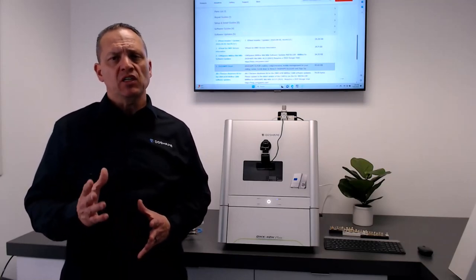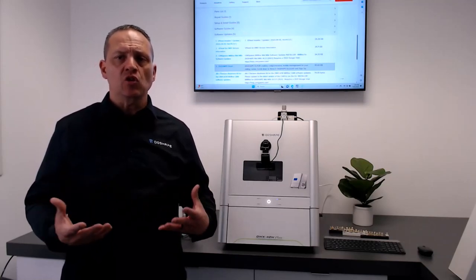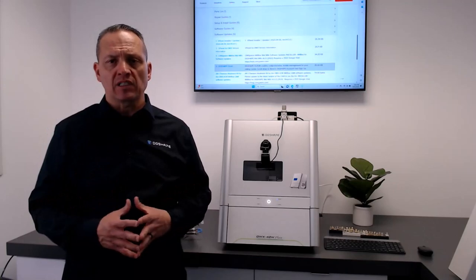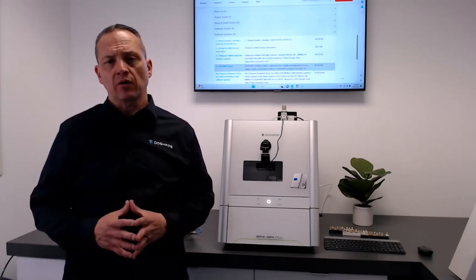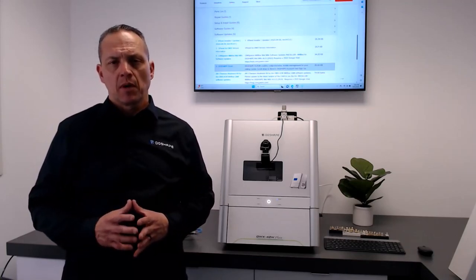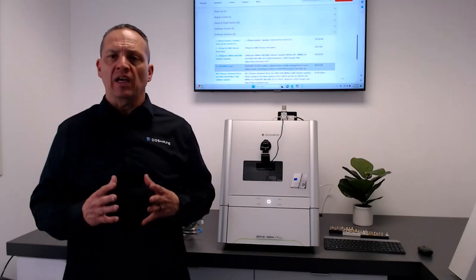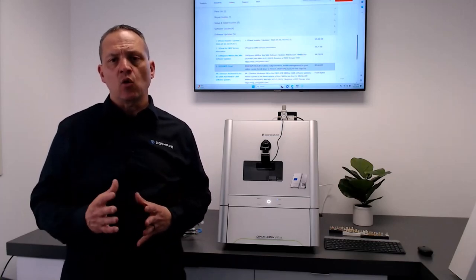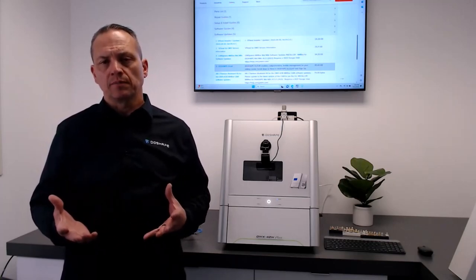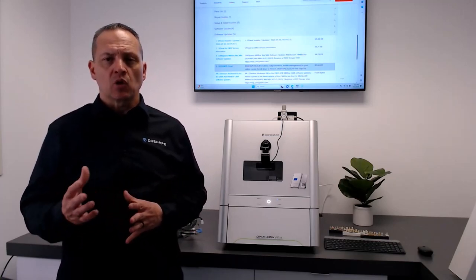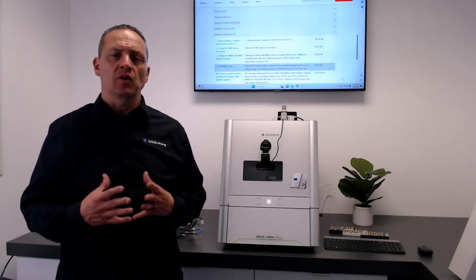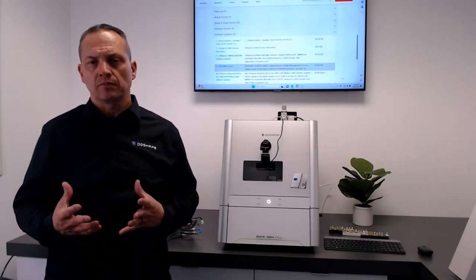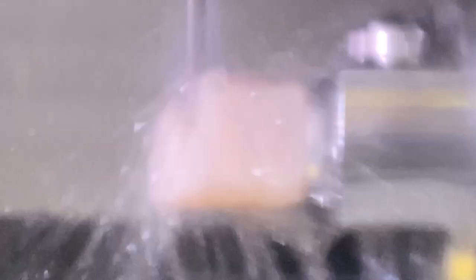CGB II milling tools for traditional glass ceramics, hybrid, and nano-composite materials. Provides finer detail and consistent quality through multiple jobs. Helps lower the frequency of chipped margins and failed milling jobs. Reduces the necessity of modifications to cement gaps for tighter fits in restorations.